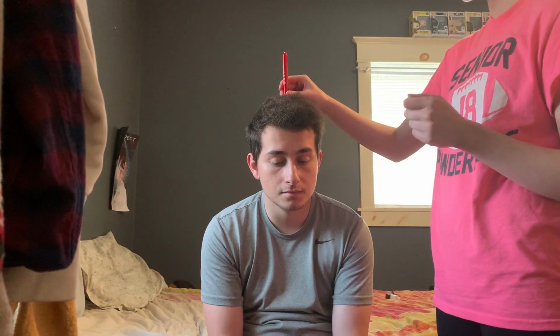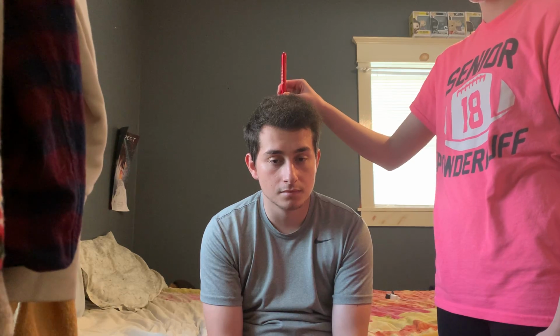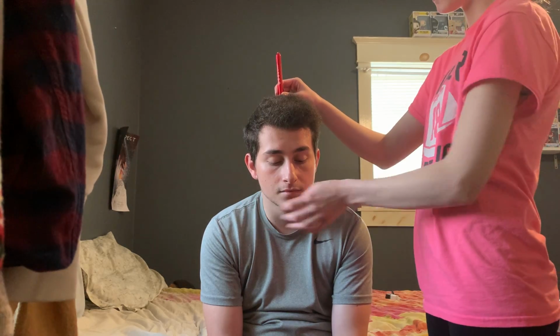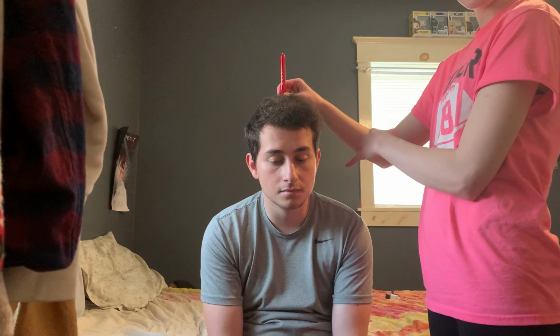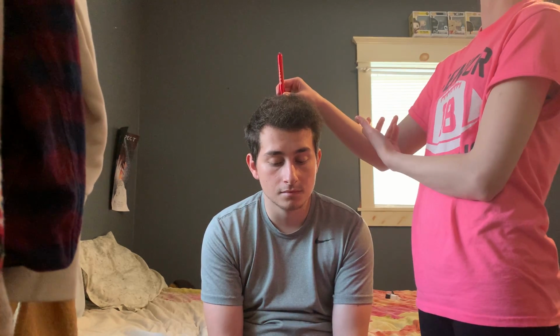And then we move on to the Weber test. Again, I would have a tuning fork, bang it off my knee. Instead of putting it at the mastoid process, I put it at the top of his head. And he would let me know if he hears the vibrations equally in both ears, or if one ear is louder than the other in regards to that vibration, or if he hears a ringing in the ear.